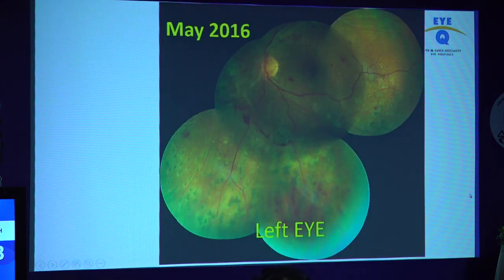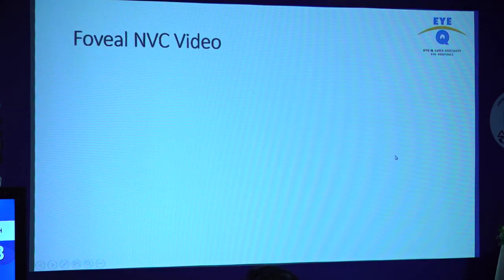Yeah, I think there is a video missing here, but again, what I wanted to show in this video was that sometimes in a very clean looking case of vitreous hemorrhage, you start operating, remove dense vitreous hemorrhage, and in the end, you realize there is a foveal neovascularization which is tightly adherent. Then also, you don't hesitate to shift to a bimanual mode. You insert a chandelier, because it is much safer to handle a foveal neovascularization bimanually rather than unimanually. You can actually segment around it.